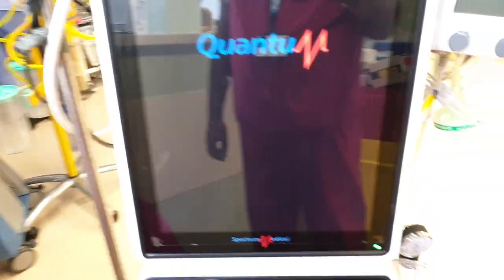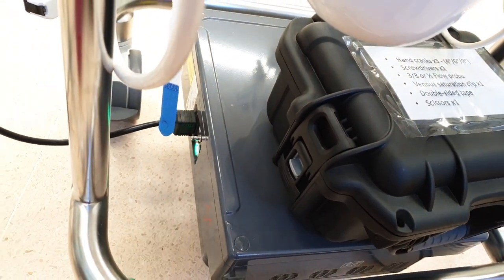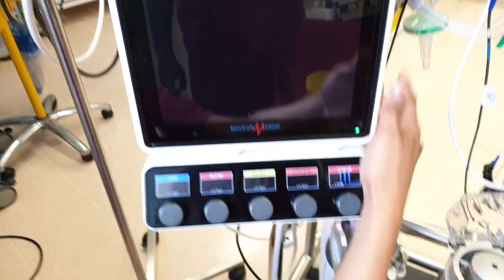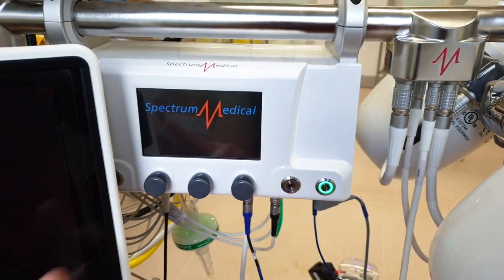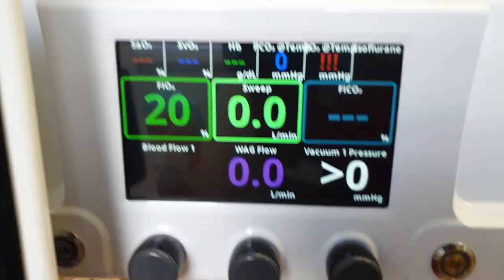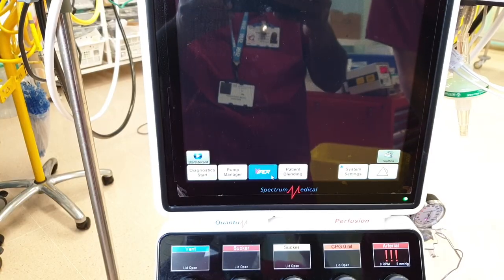So this one will turn green now. Yeah, that's good. Main pump. And then it should look here. So when you turn this on, this should go on as well. So how long would it take to boot up? Probably a minute. So it's ready. This one is booted. So that's the initial step.